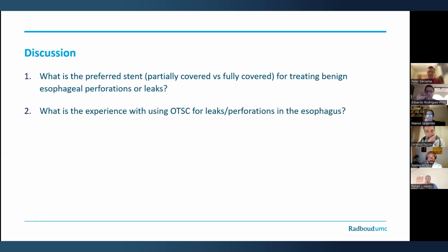Lorenzo, what's the experience with OTSC for leaks and perforation in the esophagus? Can you comment on that?